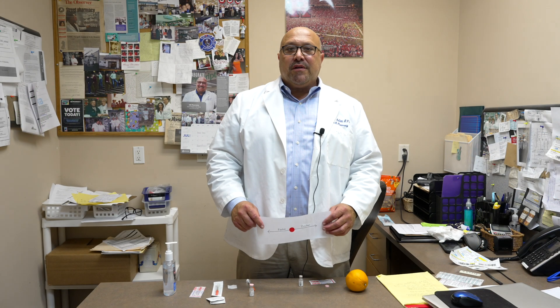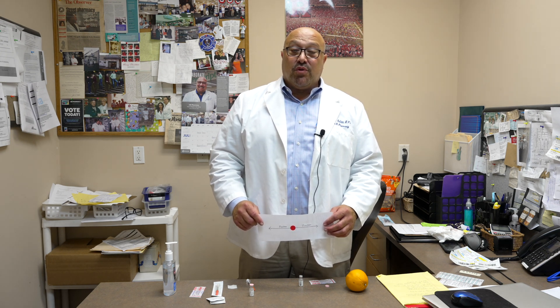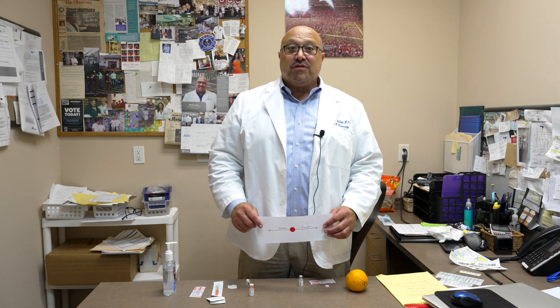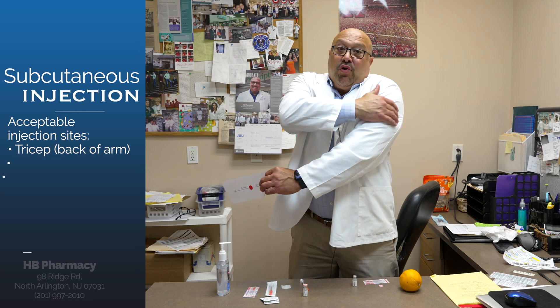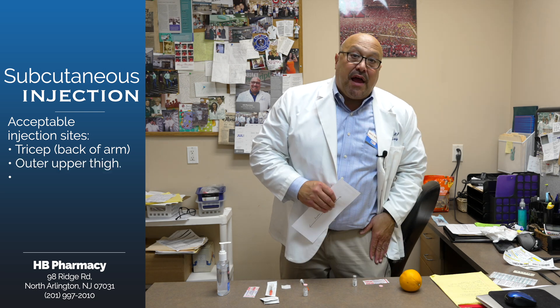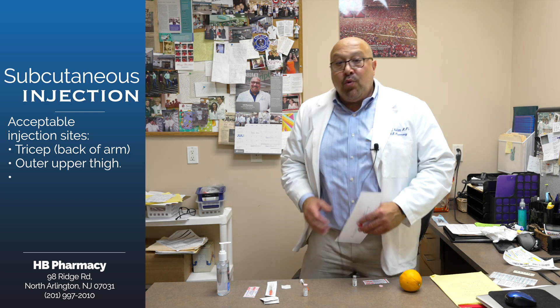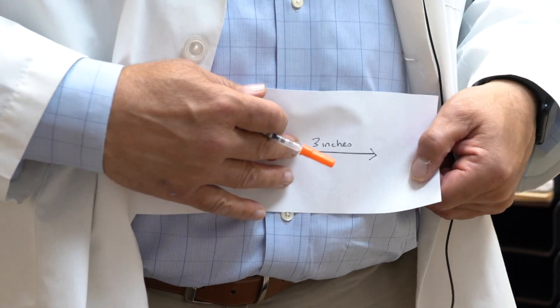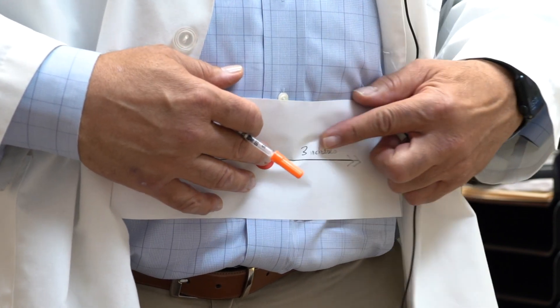Now a close-up on the suitable sites for subcutaneous injections — for things like insulin or semaglutide, etc. The back of the arm, which is the tricep, has a good area of skin and fat to grab. The other areas are the outer upper thigh, or the abdomen. For the abdomen, if the red dot is your belly button, you need to go two to three inches to either side.